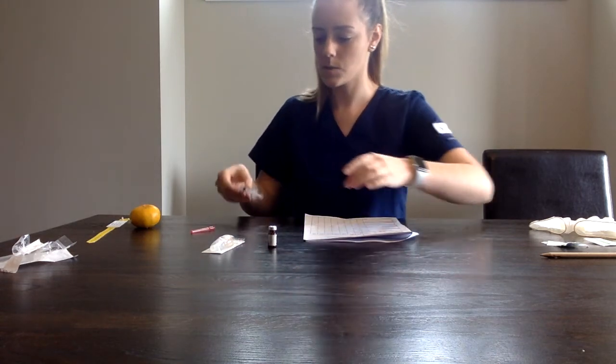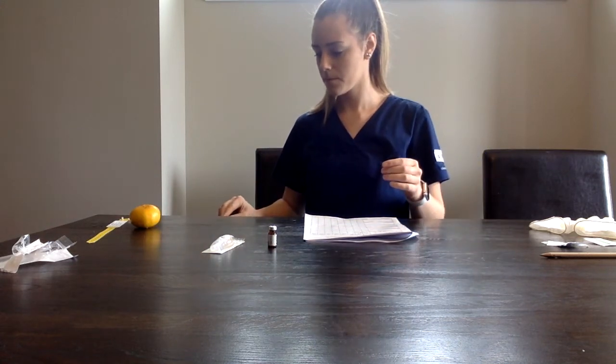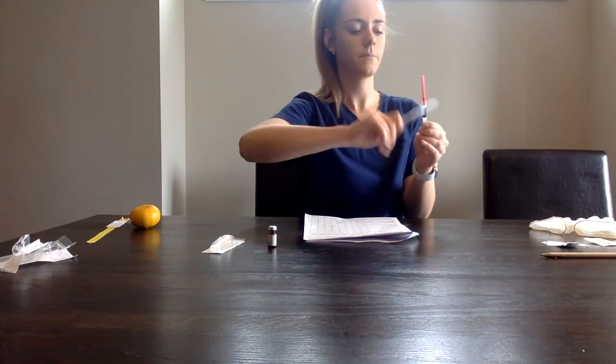So we have 1 ml. We'll use the scoop method to recap. And then we can knock out any bubbles.